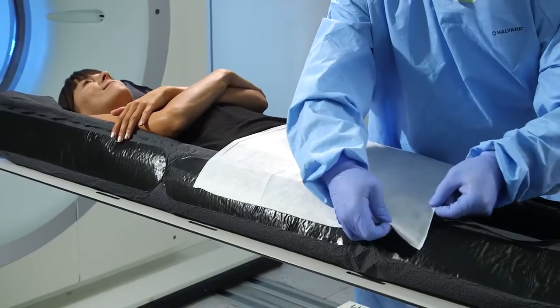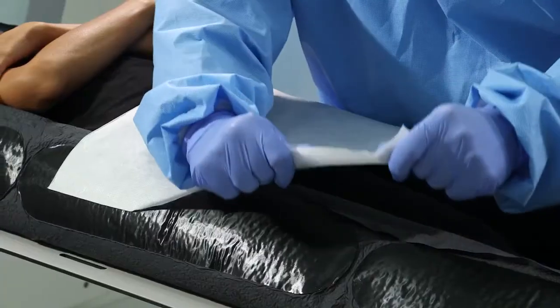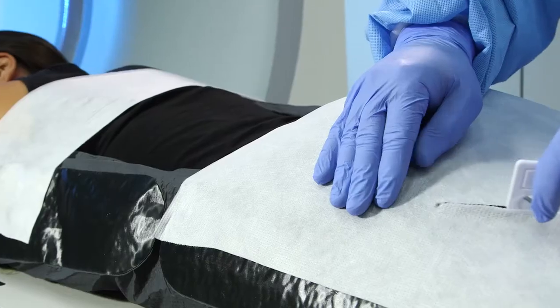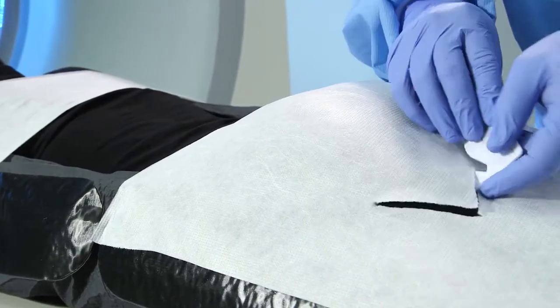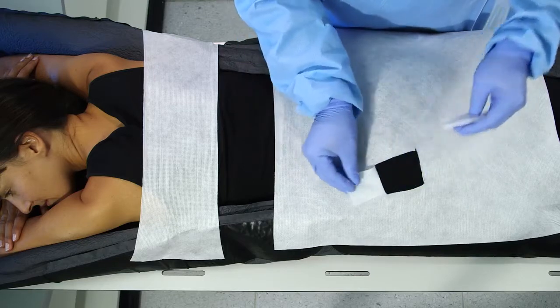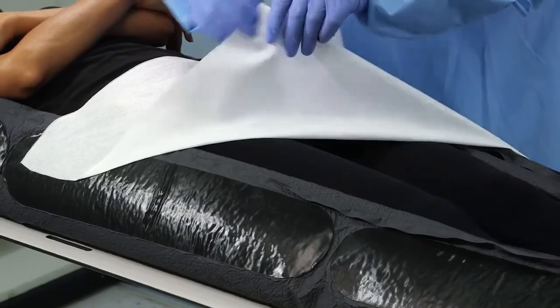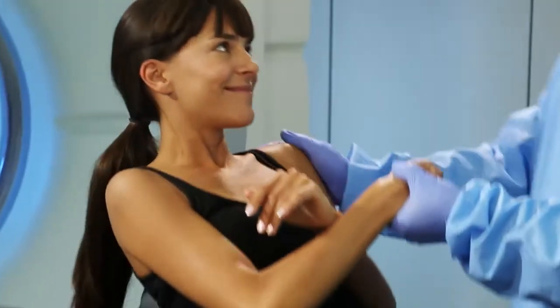If necessary, adjust the fleece to increase or decrease stabilization. If direct access to the patient's skin is required, the fleece can be cut to create a window. After imaging, the patient can be quickly and easily released by lifting the fleece off the anchor product.